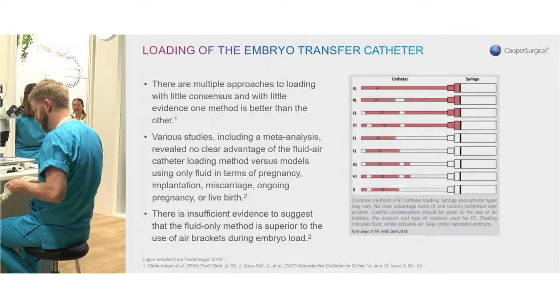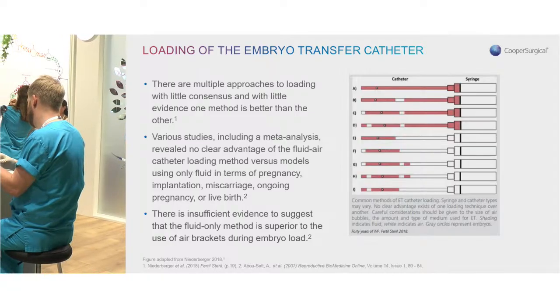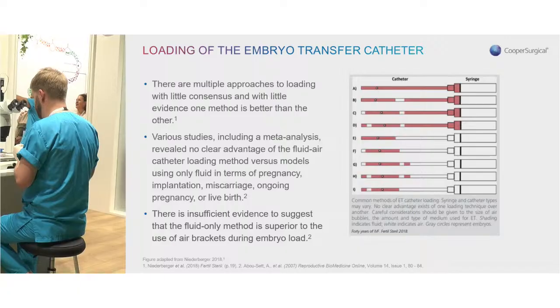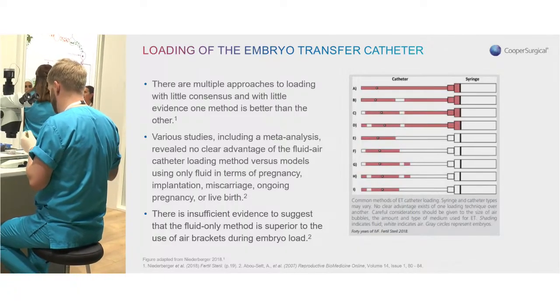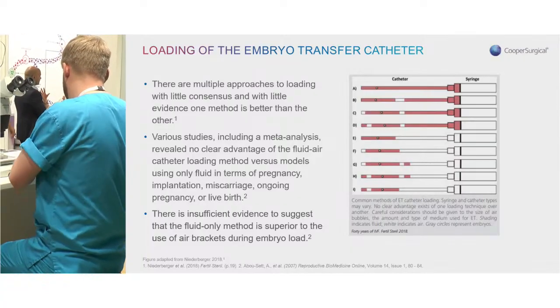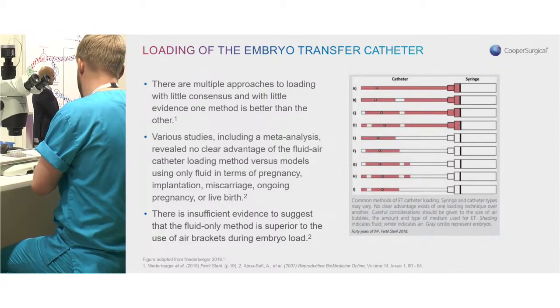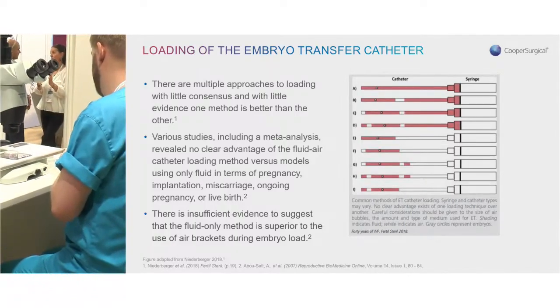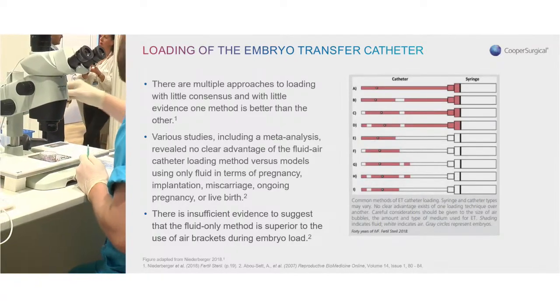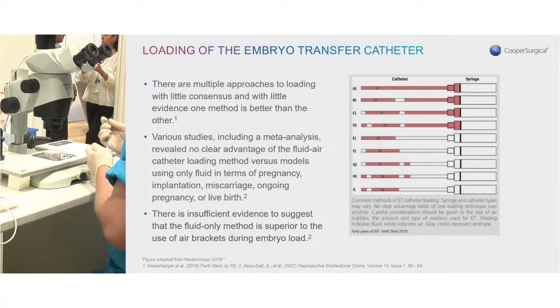So we advise that embryologists wear sterile gloves. These need to be non-toxic, they need to be tested so that they're not going to cause any issues. And we've preloaded the dish, so we've warmed up the dish with our embryo for transfer. We've done some testing previously, maybe pH testing, temperature mapping, so that we know the time we equilibrated the dish is going to leave it in an optimal condition as we come to take the embryo up into the embryo transfer catheter. So Anton's going to flush the catheter through with medium.